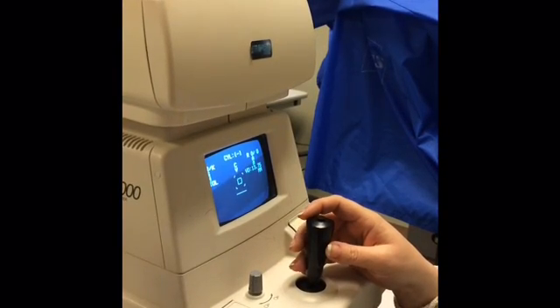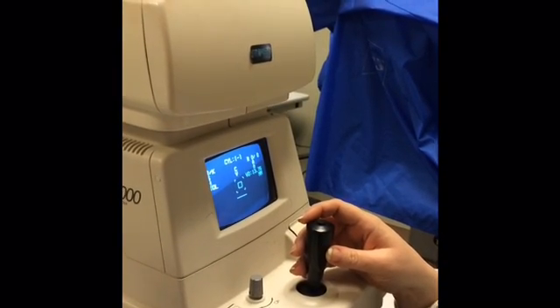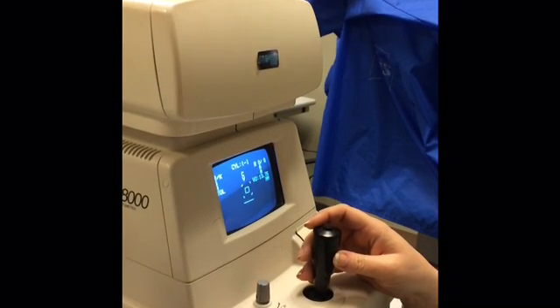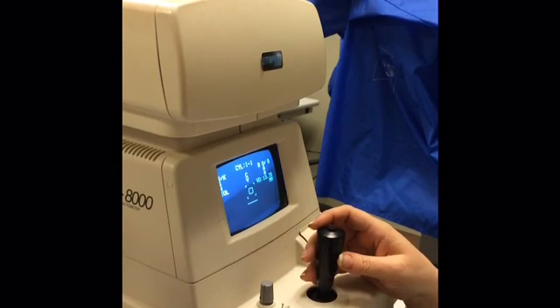As an ophthalmic assistant, the AR is one of the first instruments you will learn how to use. The AR is used to give an automated refraction, or an estimate of the patient's refractive error.